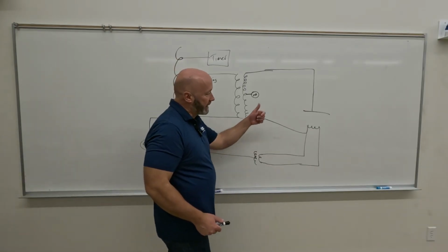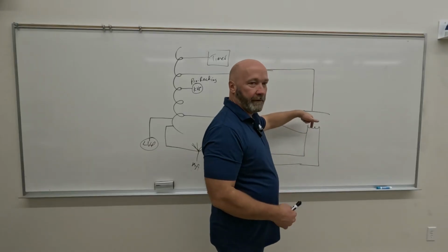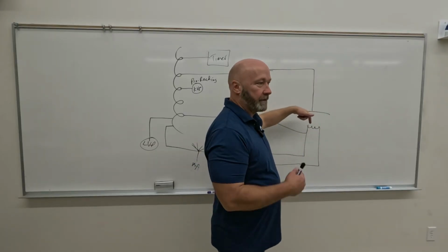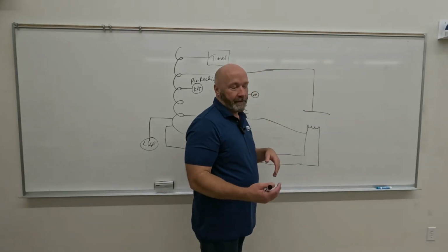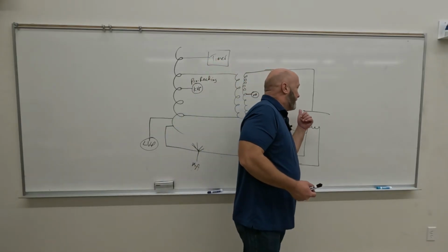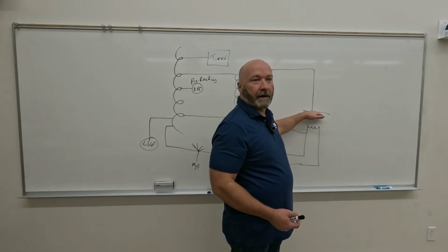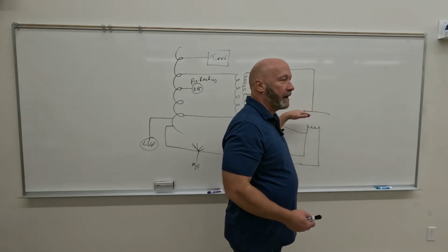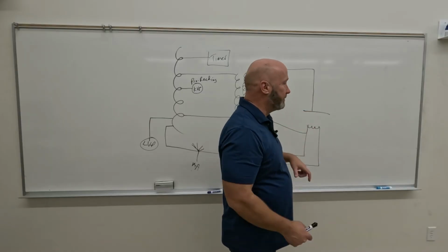We don't want to send electrons from anode to cathode because it would break your filament right away. Single exposure is gone. Even though that's probably pretty unlikely to happen, because you'd have to get this thing to the point of thermionic emission, right? Which, sure, you're going to have to put a lot of mAs through this to get to thermionic emission on a big chunk of metal.